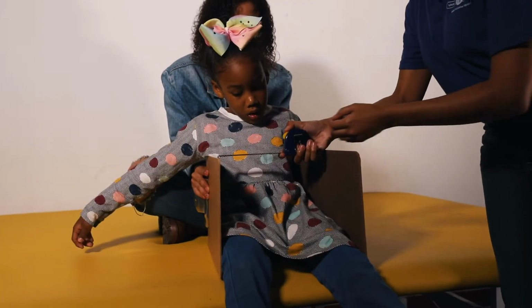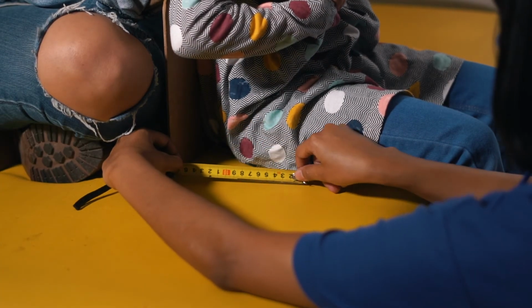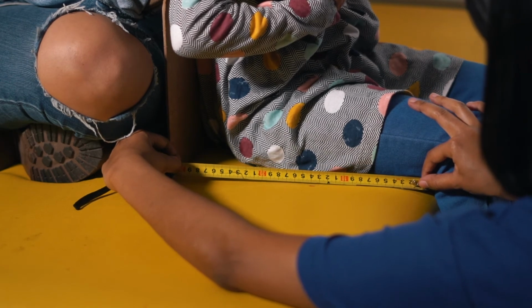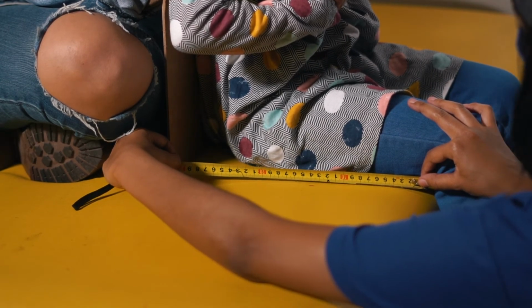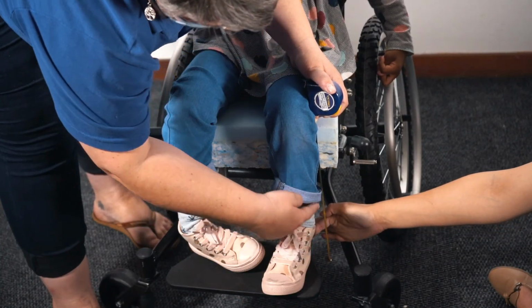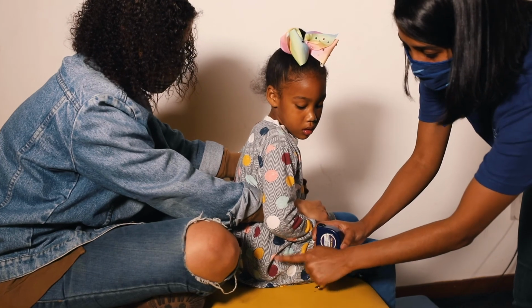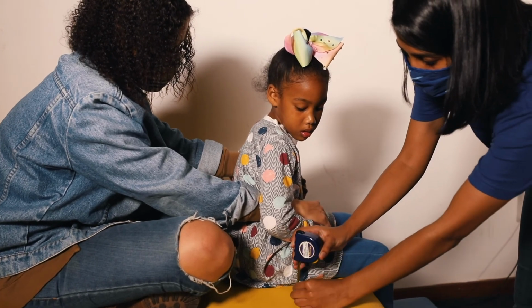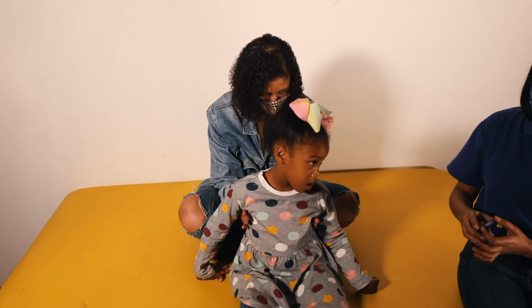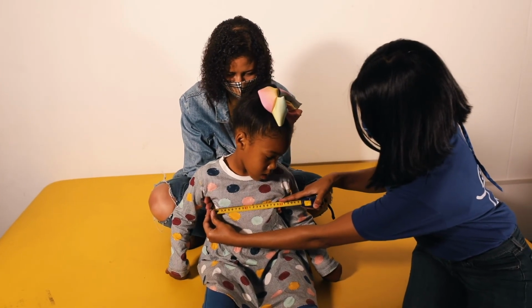The measurements must be taken from one side to the other side of the hips with a straight measuring tape. Practitioner measures from behind the buttock to the bend of the knee, or popliteal fossa, with a straight measuring tape. Practitioner measures from the bend of the knee, or popliteal fossa, to the feet. Practitioner measures from the seat to the bottom of the elbow bend. Practitioner measures from the outside of the nipple line straight over to the outside of the other nipple line.